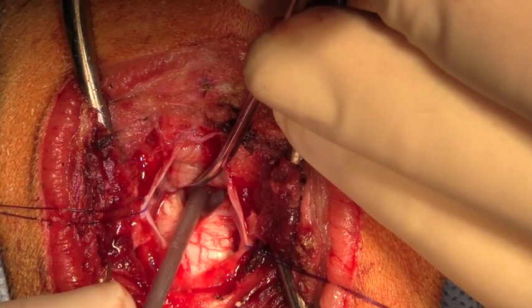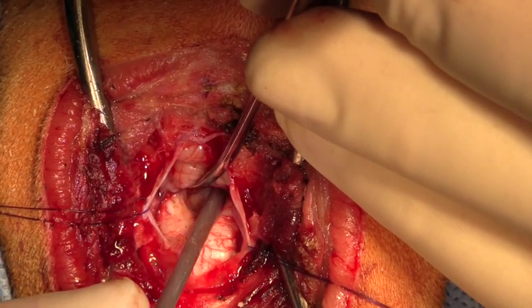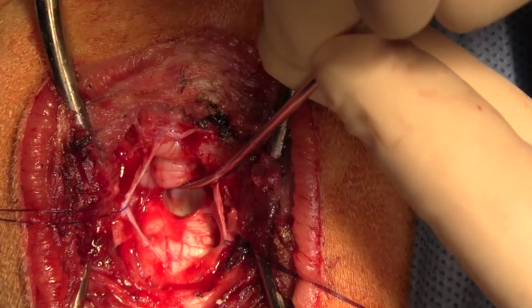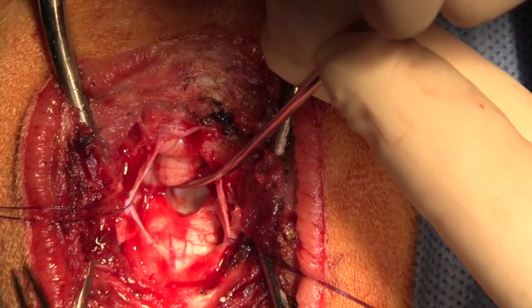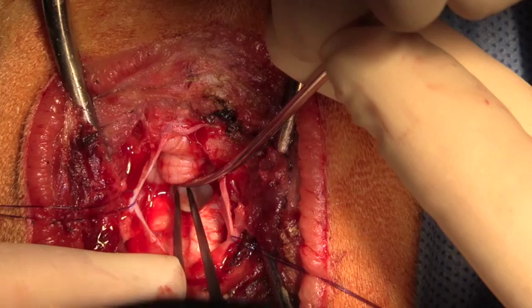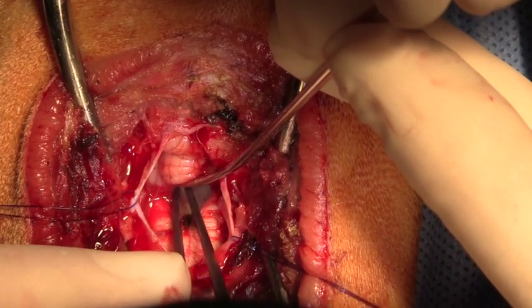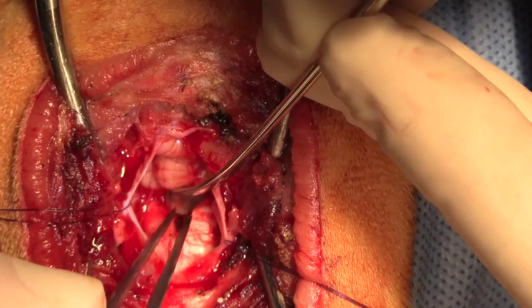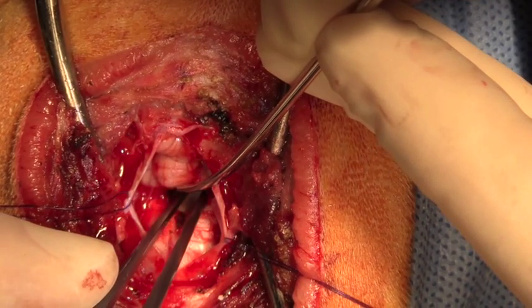Now we're looking at the floor of the fourth ventricle just beneath the vermis of the cerebellum. At this point the floor of the fourth ventricle can be clearly seen where the tumor has been removed. We're using bipolar electrocautery to cauterize the stalks of the choroid plexus in order to avoid recurrence of the tumor.